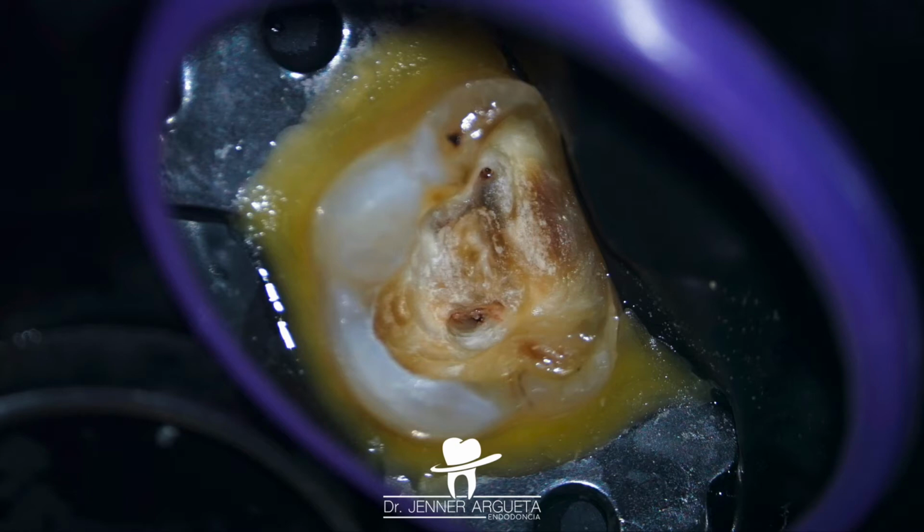It's important to analyze all the colors and all the calcifications that we can see at the pulp chamber, and as you can see we have here this dark area that corresponds to the floor of the pulp chamber. This yellowish area corresponds to the calcification of the tertiary dentin that was formed at the pulp chamber due to the external stimuli that was affecting the tooth for a long time.